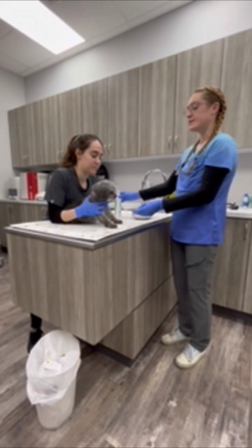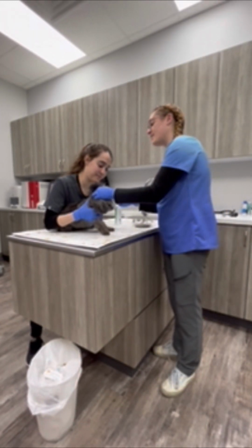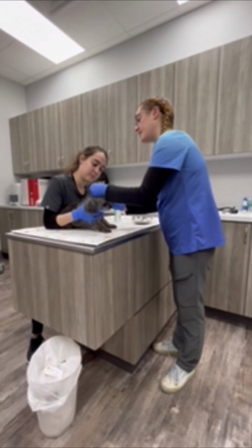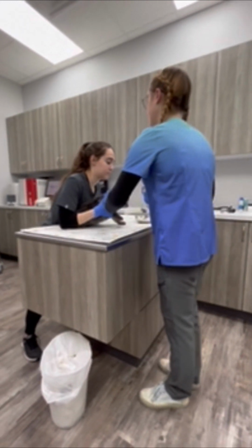And allowing her to shake to get any excess solution out. Good girl. And then with the sterile gauze, I'll be wiping the pinna and the external ear canal to clean out any debris and excess solution that was left behind. Then the same process on her right ear.